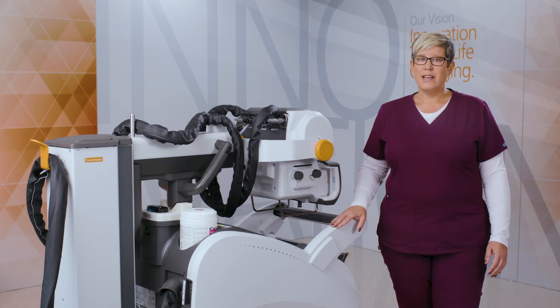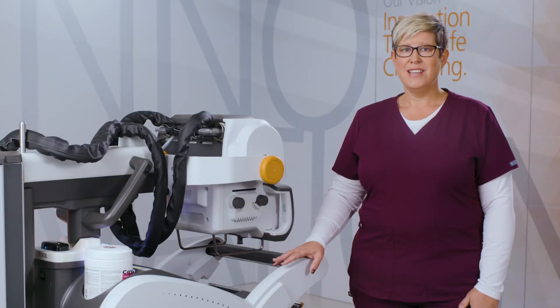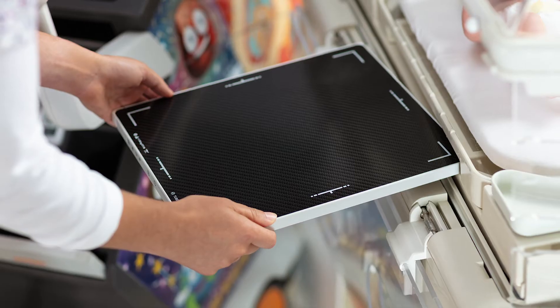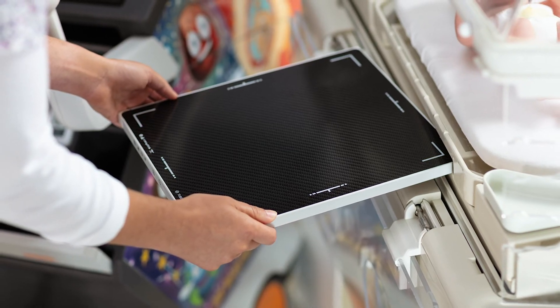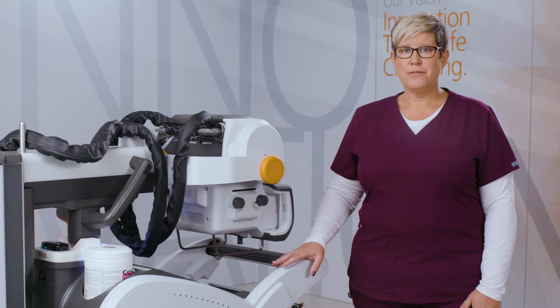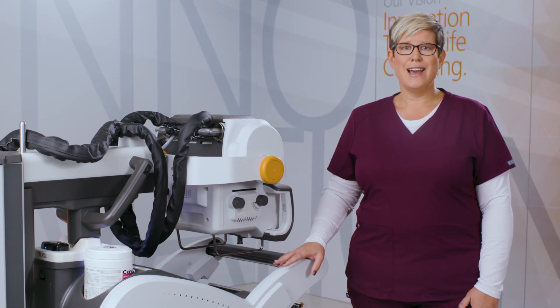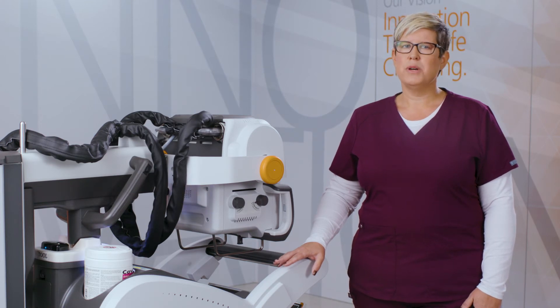These are available in a variety of sizes. The DRX Plus 2530C detector is the perfect complement to the DRX Revolution for imaging pediatrics. Its smaller size fits easily into a neonatal incubator tray for minimal disruption, and the cesium iodide scintillator is excellent for dose-sensitive patients, all while delivering superb image quality.